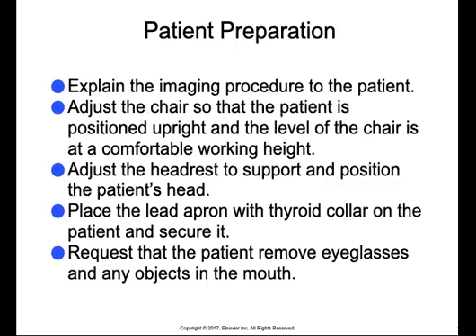So starting with patient preparation, after completion of infection control procedures and preparation of the treatment area and supplies, the patient should be seated. So first, you want to briefly explain the imaging procedure to the patient. You want to adjust the chair so that the patient is positioned upright and the level of the chair is set at a comfortable working height. You will also adjust the headrest to support the patient's head.